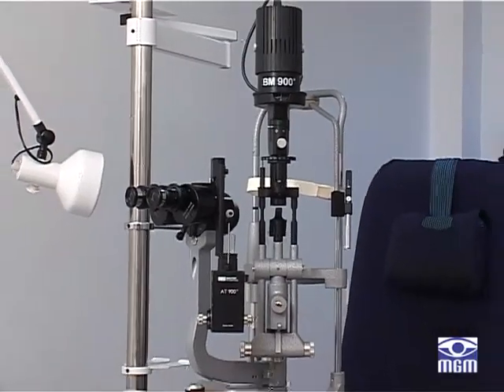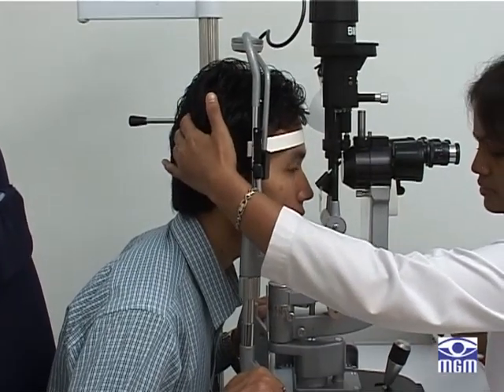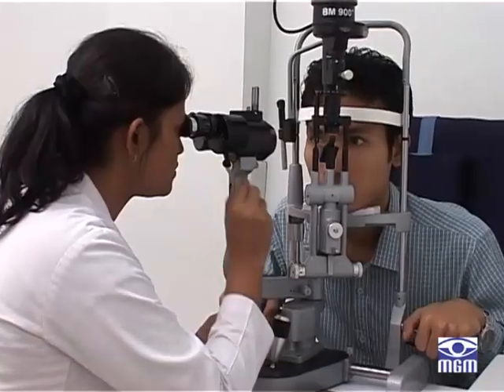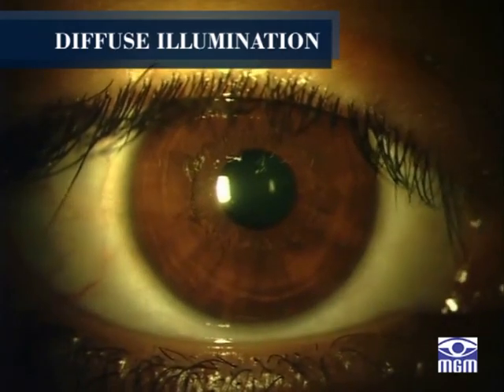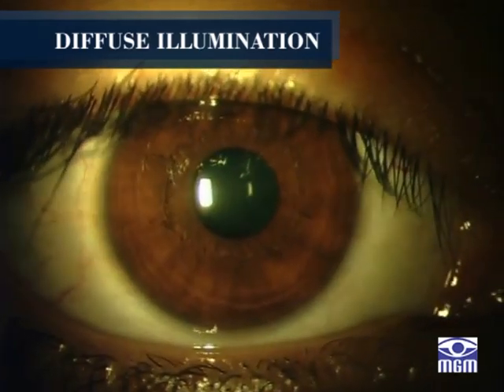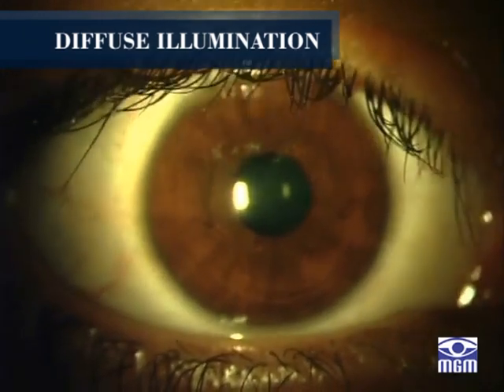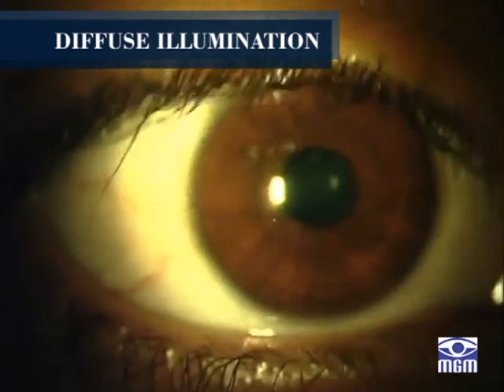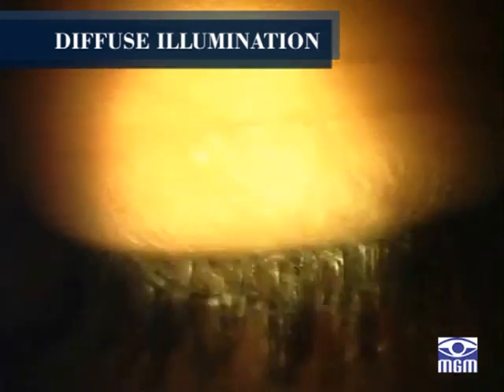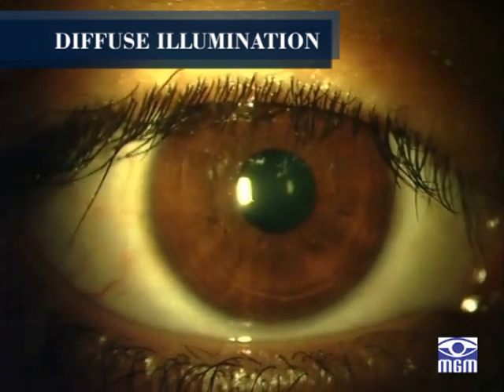Before beginning the slit lamp examination, the patient has to be seated comfortably. His chin should be placed on the chin rest and the forehead should be attached to the forehead band. First of all, a diffuse light examination is performed. This facilitates simultaneous observation of large areas at low magnification. All the intraocular and extraocular structures can be quickly reviewed for gross abnormalities.